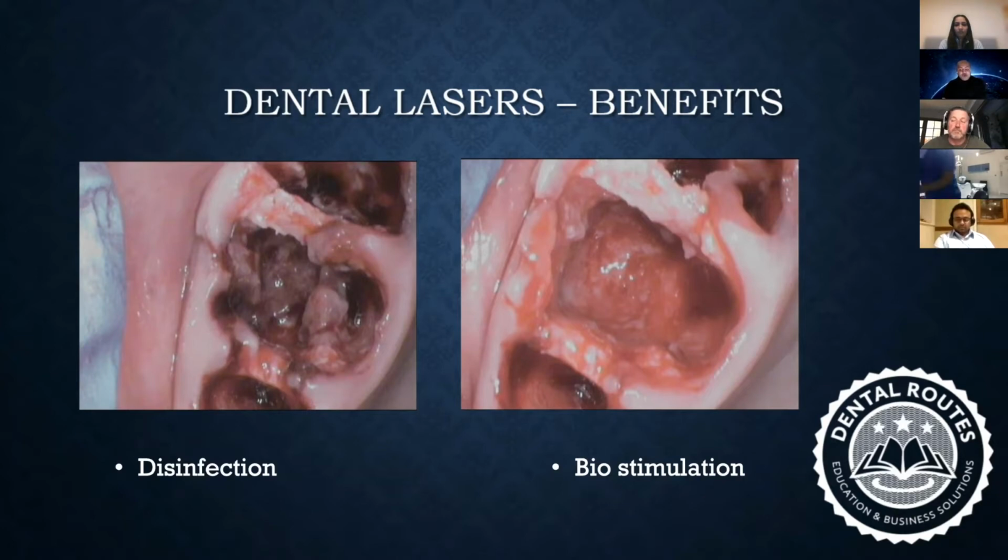And even if I do it, how confident am I that I can go ahead and place my bone augmentation or place my implant in that site? I personally am not confident at all. And that is how the laser has made such a big difference, because this area is crisp and clean.